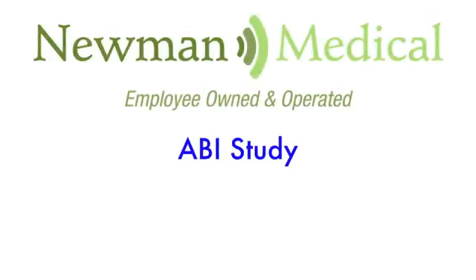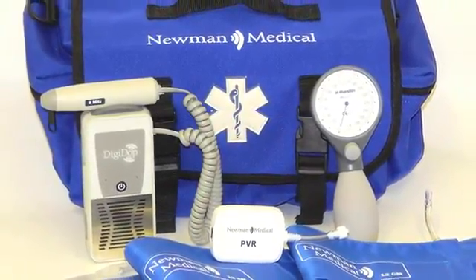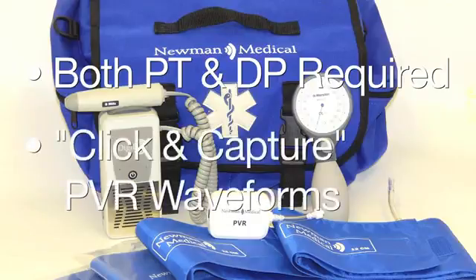The ankle brachial index, or ABI, is the best known and standardized test for diagnosing PAD. Fundamentally, it is a comparison of the ankle systolic pressure to the arm systolic pressure. Simple ABI systems assist in performing this test quickly and accurately, following the clinical and CPT recommendations for the ABI exam. These recommendations include obtaining the systolic pressures using a Doppler at both the PT and DP arteries at the ankle and including a pulse volume recording, or PVR, waveform at the ankles.